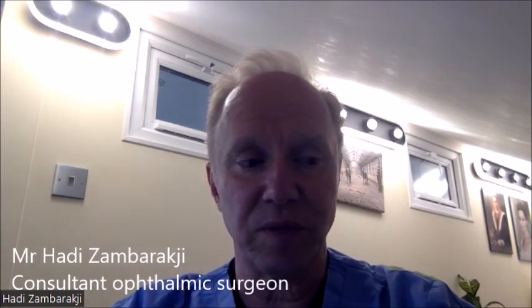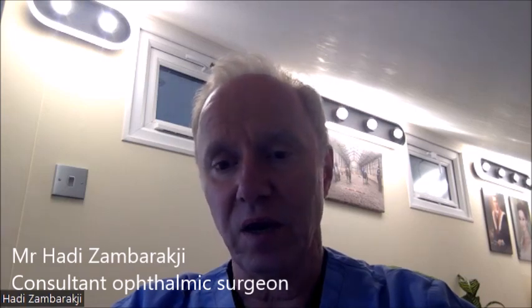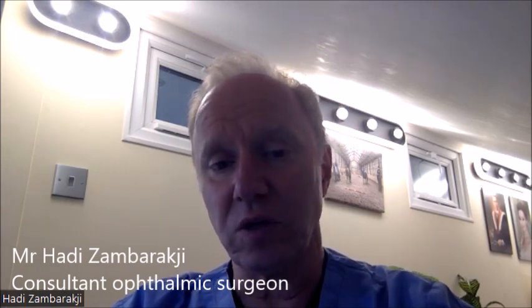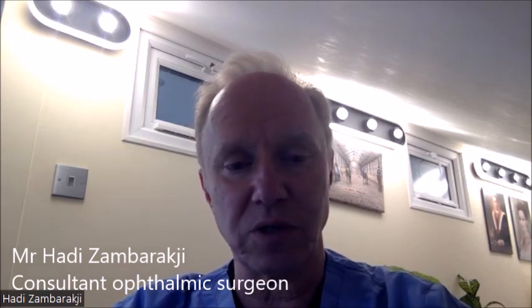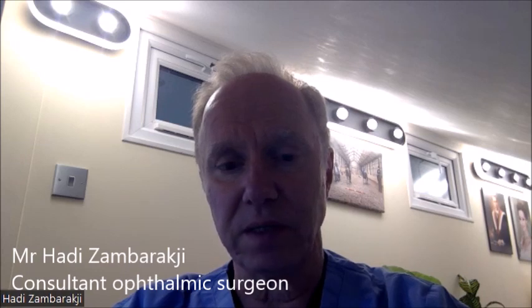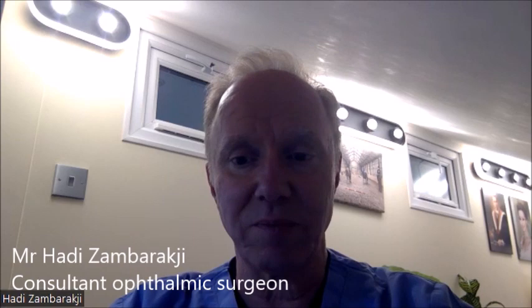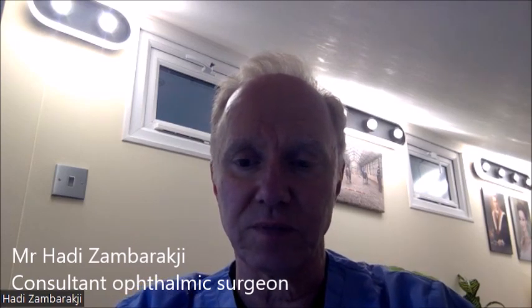They don't have any of the side effect profiles of multifocal lenses. But I still do use a significant number of multifocal lenses for some patients, particularly younger patients who seek spectacle independence, and therefore both lens implants are quite good, depending on the patient you're trying to treat.